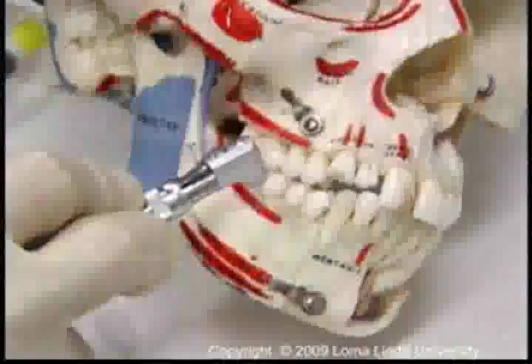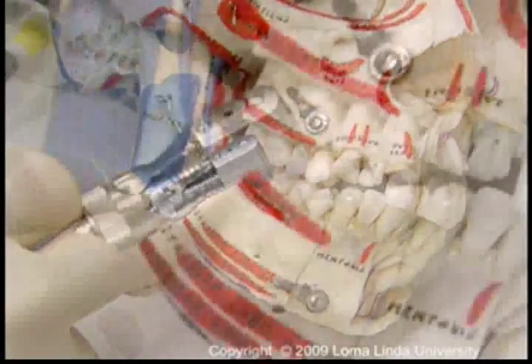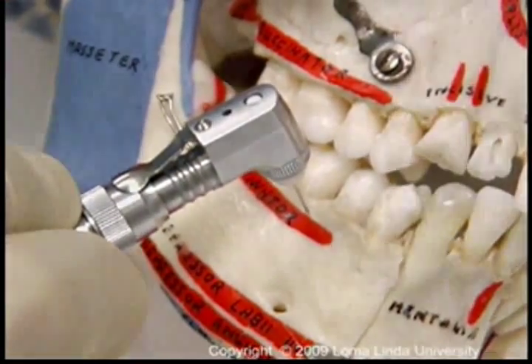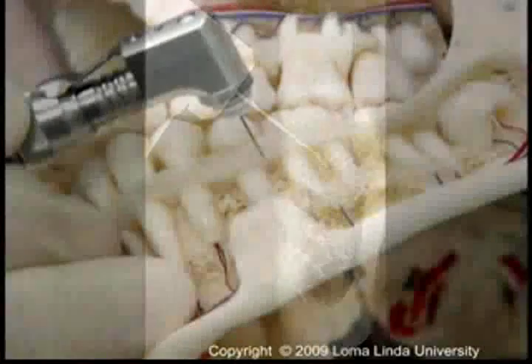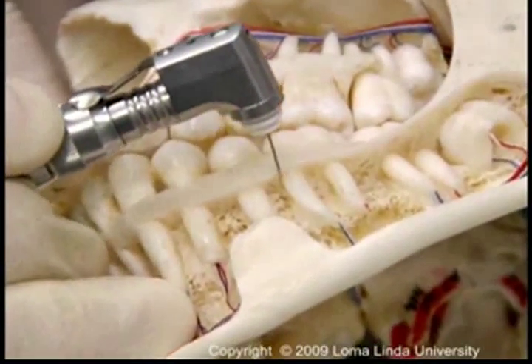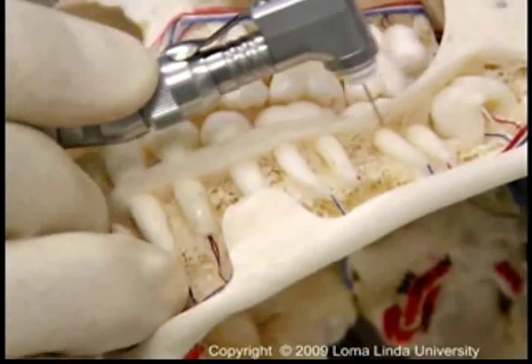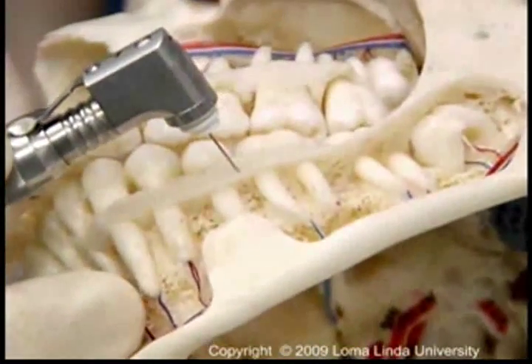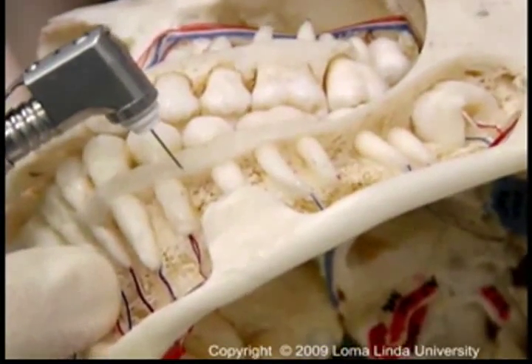The perforator and a matching ultra-short needle are shown here. If the premolar is to be anesthetized, the perforator is positioned at approximately a 45-degree angle to the bone. After penetration, the perforator tip drops into the medullary space. Note that on the mandible, the cortical bone is dense and it increases in thickness to the posterior. This is why the posterior mandible is difficult to penetrate with the perforator.